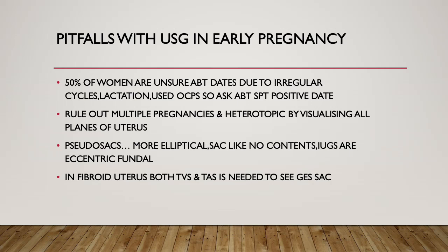Now there are some pitfalls with ultrasound in early pregnancy. We cannot diagnose on the first scan because there are some discrepancies, like 50% of women are unsure about their dates due to irregular cycles, maybe prolonged cycles, maybe they are lactating, maybe they just stopped the OCPs and their cycles are not regular. So we should confirm the gestation from when their SPT became positive. Ultrasound also detects multiple pregnancies and heterotopic pregnancy by visualizing all planes of the uterus.